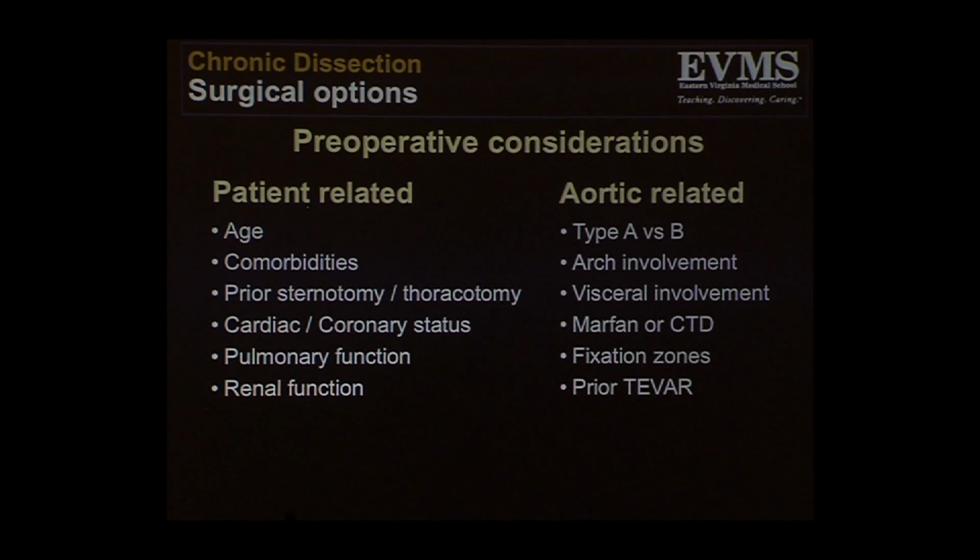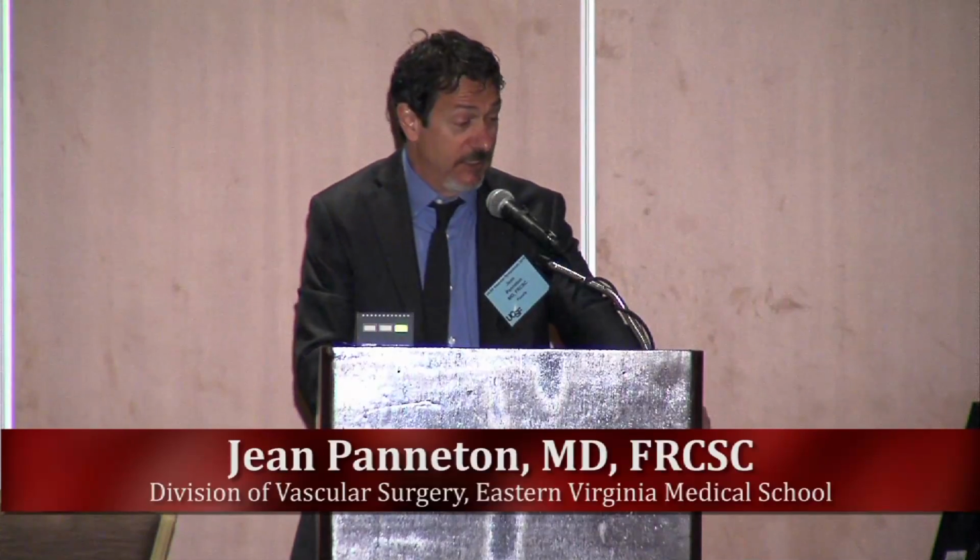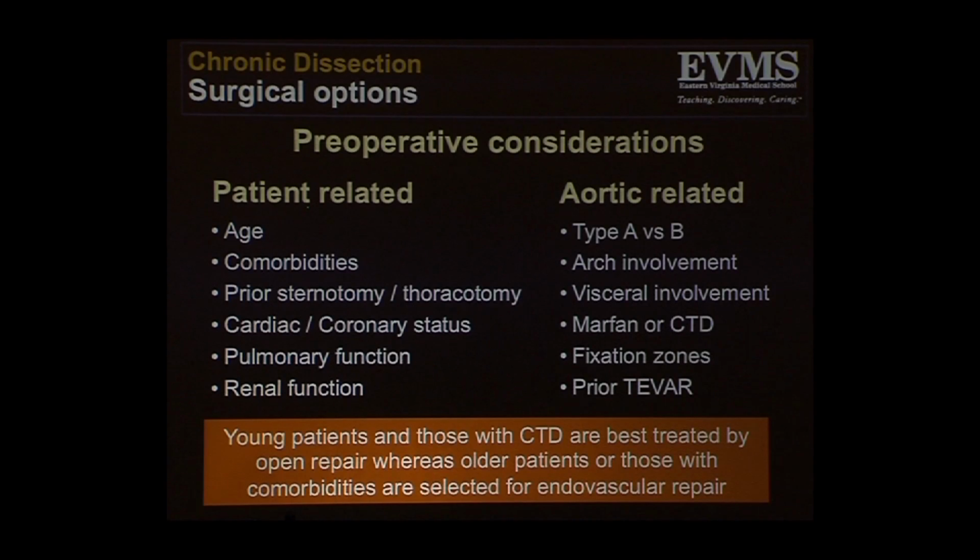And if the patient had a prior TEVAR, which is not unusual for us to be referred, the easy part was done, and now we have to deal with the more difficult redo part. In general, these are the guidelines that I use. Young patients and those with CTDs are best treated by open repair, whereas older patients or those with significant comorbidities tend to be selected for a more endovascular approach.